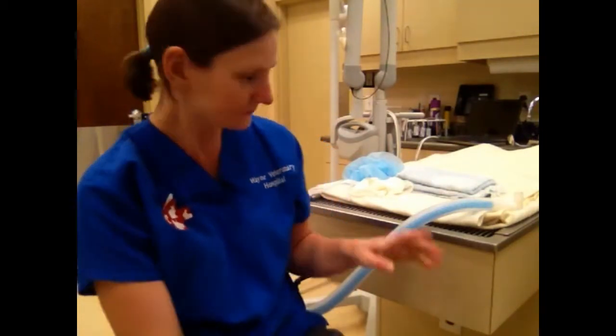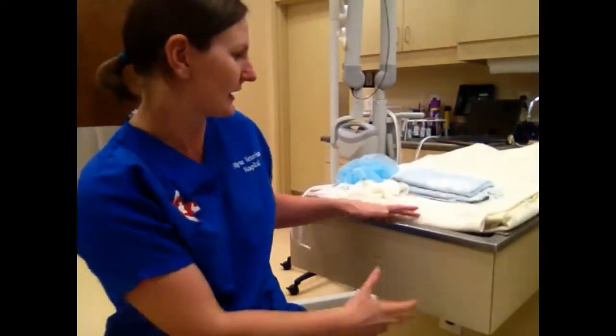So I just wanted to go ahead and talk a little bit about safety, both for myself performing the dental and obviously for the dog. While we're performing a dental, the dog will be under general anaesthetic. So we have already placed a catheter, so we've got venous access throughout the procedure. We also have our anaesthetic machine correctly assembled, and we have a monitoring device to monitor all the parameters while the dog is under anaesthetic, and we'll also have somebody on hand monitoring the anaesthetic and the animal while I'm performing the dental.